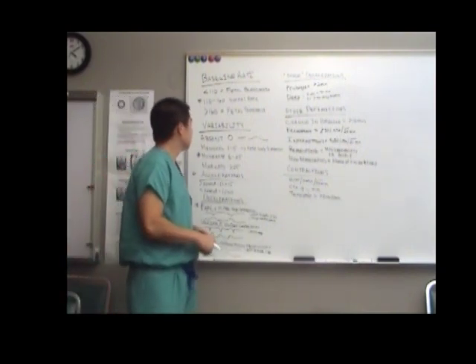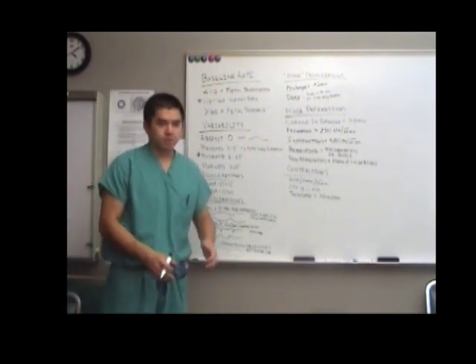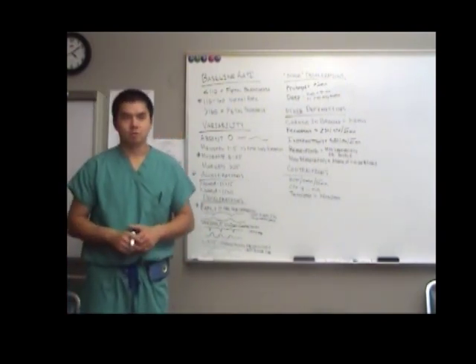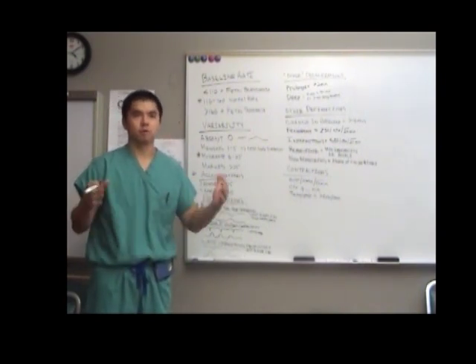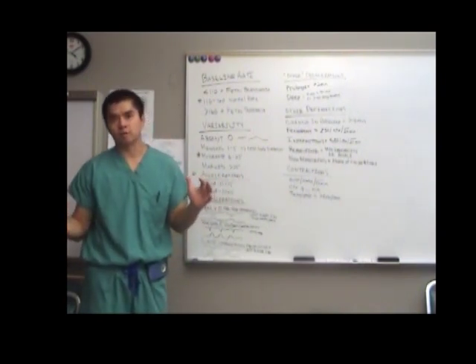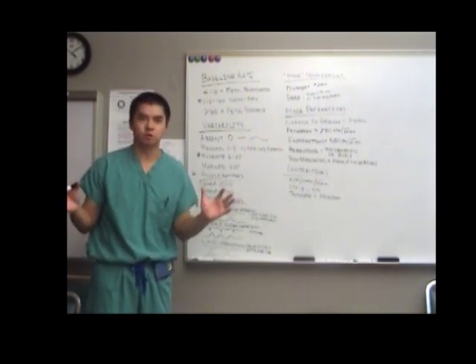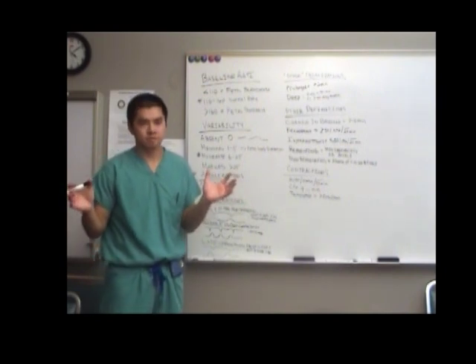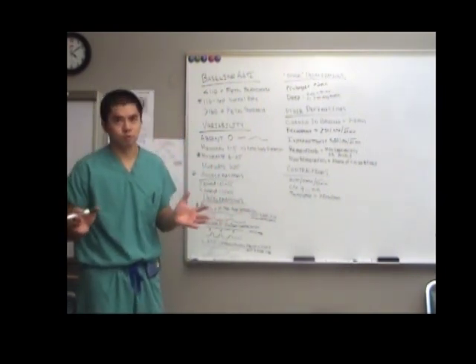So in other words, if you say, oh, we have a prolonged deep decel, and that's all you say, or you just say, oh, we have category 1 or we have category 2, they could draw a category 1 or a category 2 strip, but how many different types of category 2 strips are out there? There's thousands, maybe millions, and it may not be the one that you're reproducing.